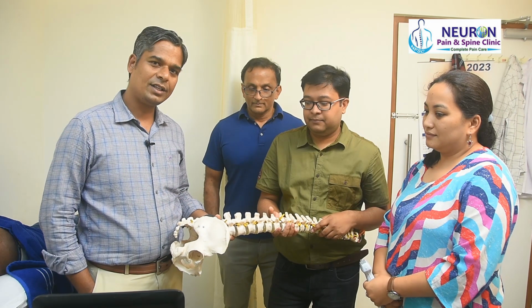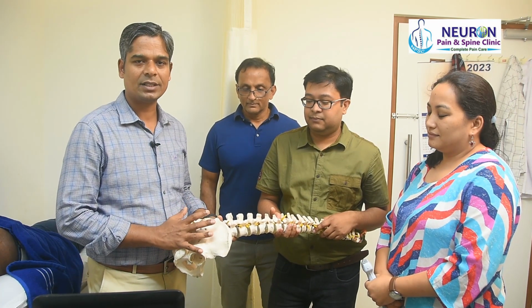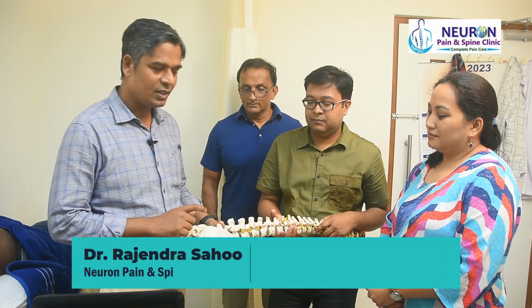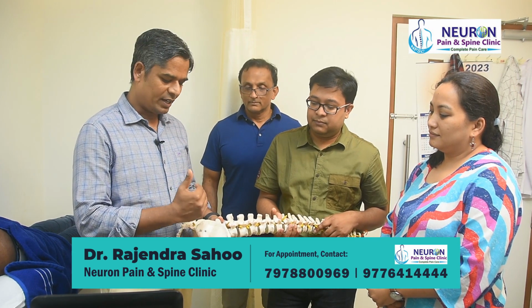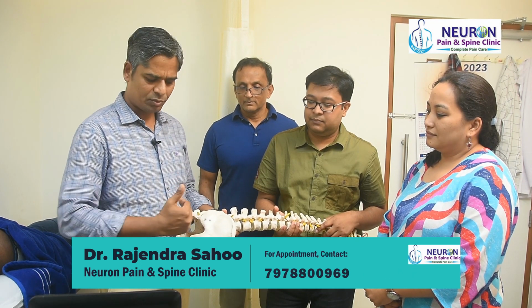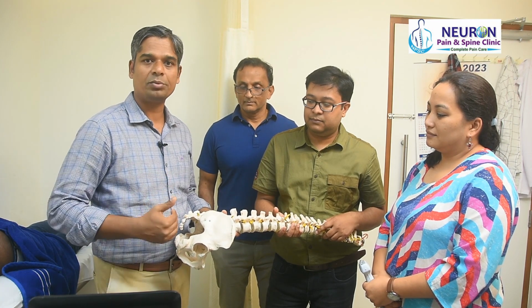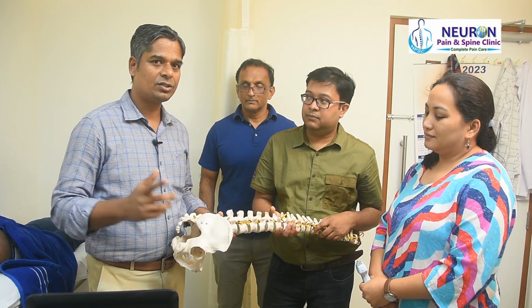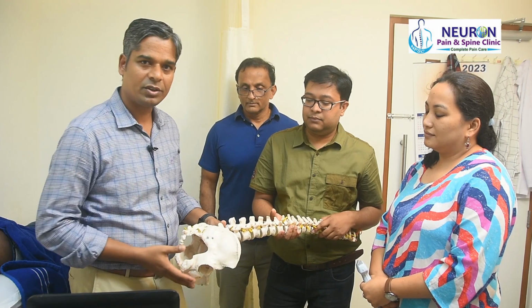Today in this video, I'm going to show you one of the most difficult scanning parts, that is the gluteal and pelvis ultrasound. So in this video, I'm going to show you how to scan in a stepwise systematic manner to identify the gluteal muscles, the piriformis, the pudendal nerve, and then of course going down below the quadratus femoris muscle for the ischiofemoral impingement syndrome. Okay, so please watch this video till the end so that you can have an idea to understand the anatomy of one of the most difficult parts.